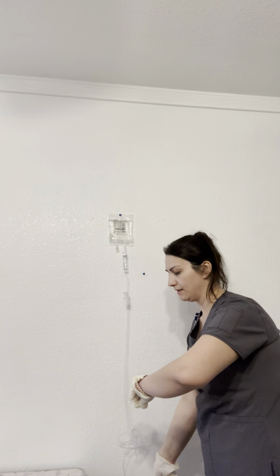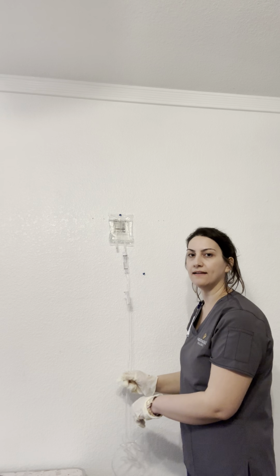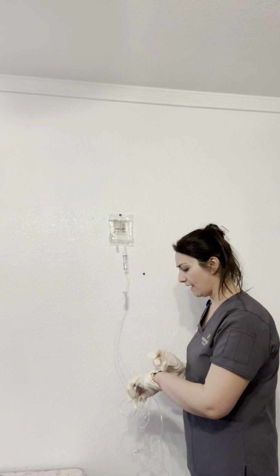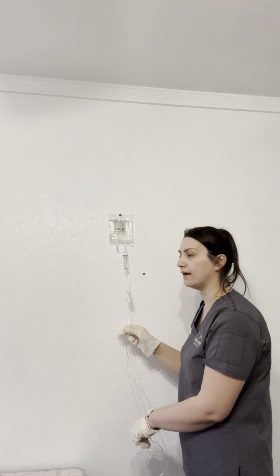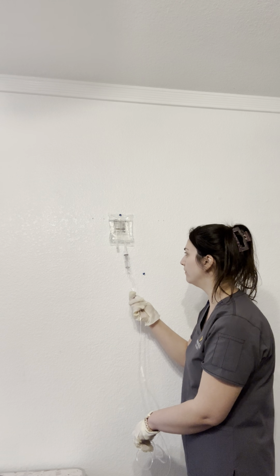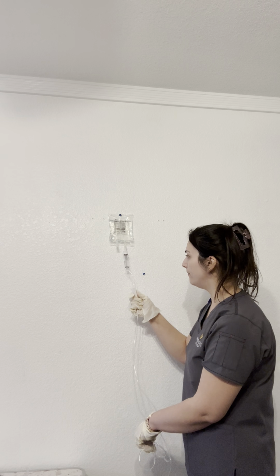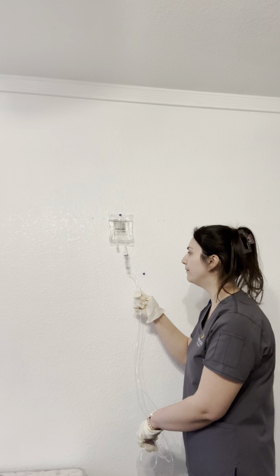We're going to count. So the primary rate is going to be 38 drops per minute, and we're going to document that. We're going to look at our watch for 1 minute, and we're going to make sure that there's a good amount. We're just going to adjust this so it drops 38 per minute.